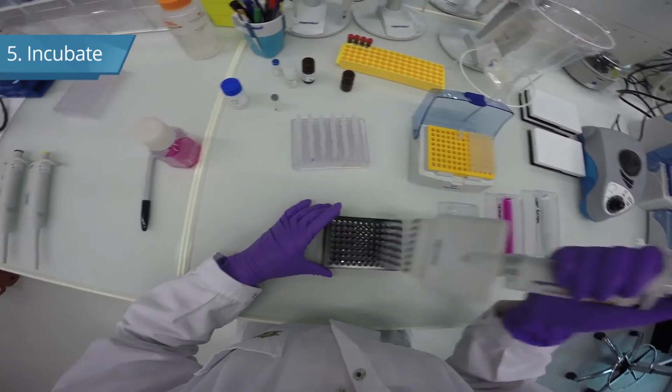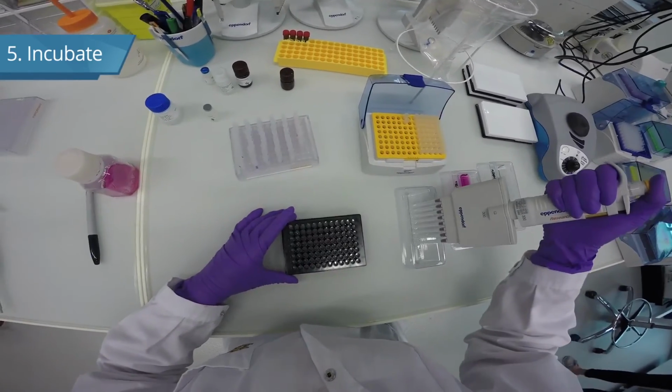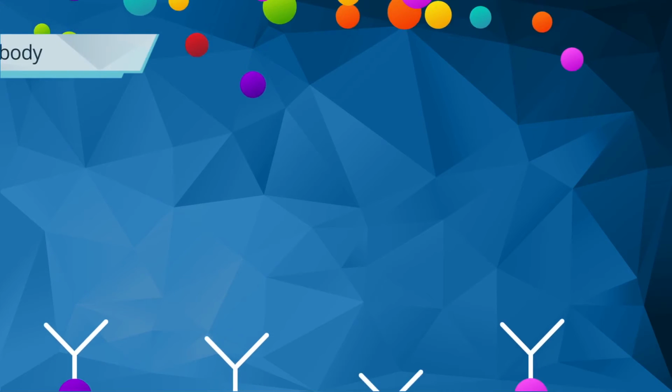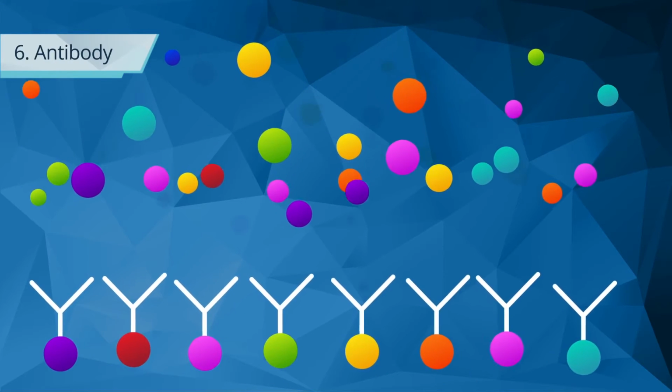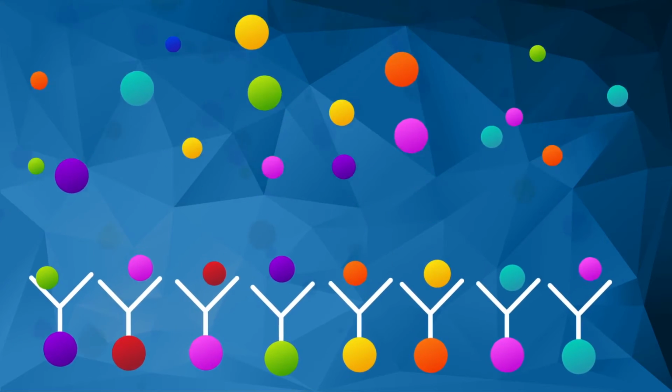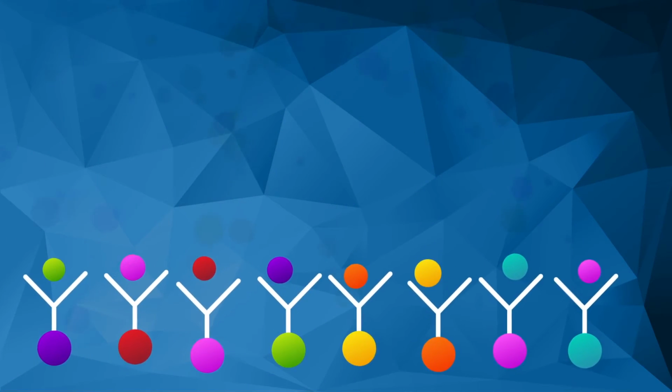Next, the bead cocktail is added to each of the samples and left to incubate for 1 hour. The relevant proteins bind to the appropriate antibody. The excess proteins are washed off, leaving behind just the bound proteins.